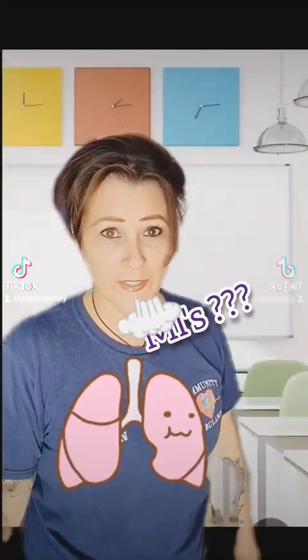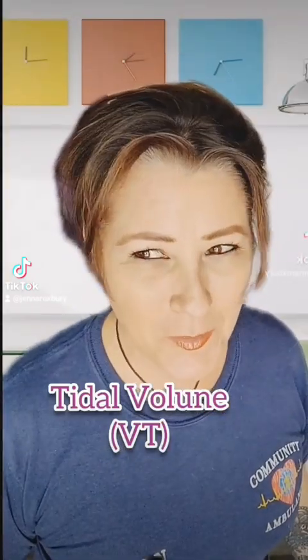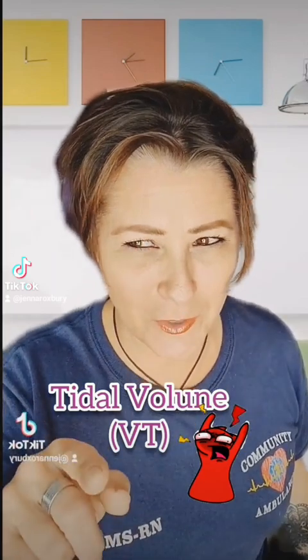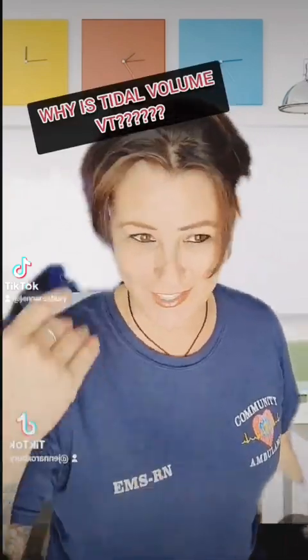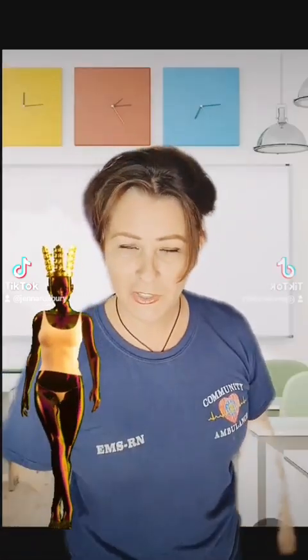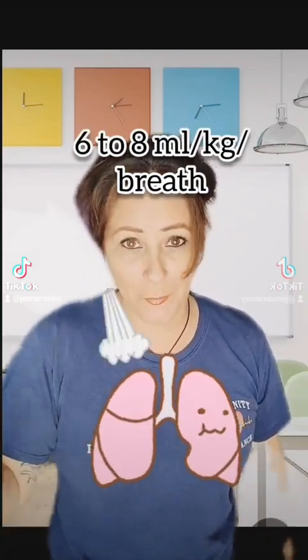So now what? Now we need to determine how many milliliters of air we have to give for each breath. That's the tidal volume. Can an RT out there smarter than me explain why tidal volume is VT? I hate it. My OCD won't let me. Anyways, I digress. So the average human being without disease processes, which I'll talk about in a later video, requires between 6 and 8 milliliters per kilogram of air per breath.